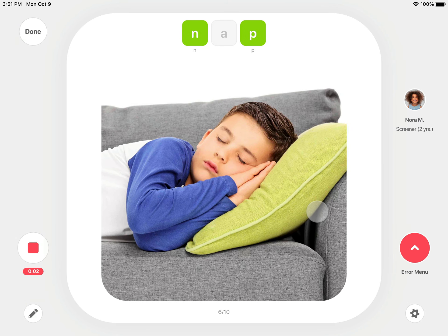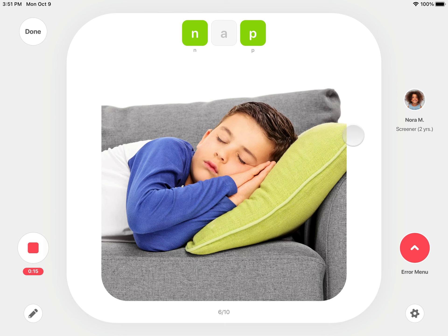If the student does not know a word, tap the picture for an audio prompt. The green scoring tiles represent the sounds being tested. If the student says the sounds correctly, do nothing with the scoring tiles.